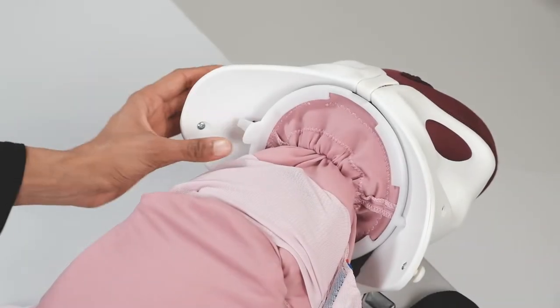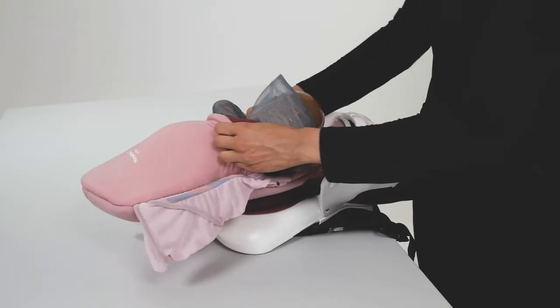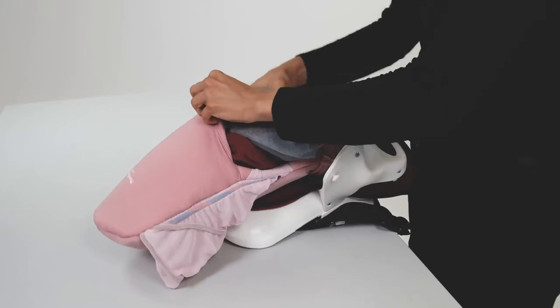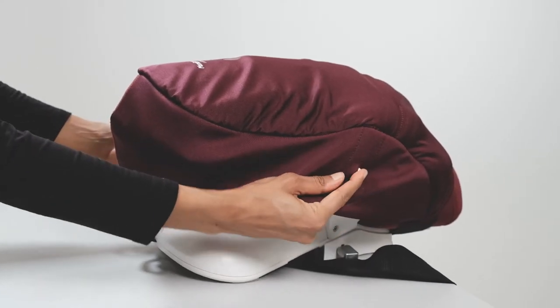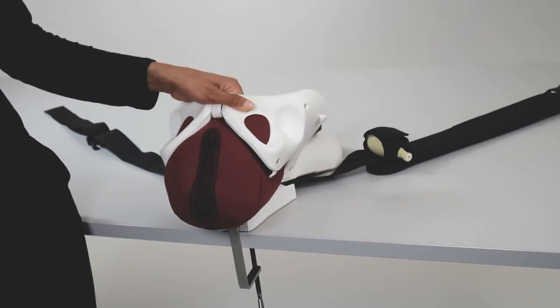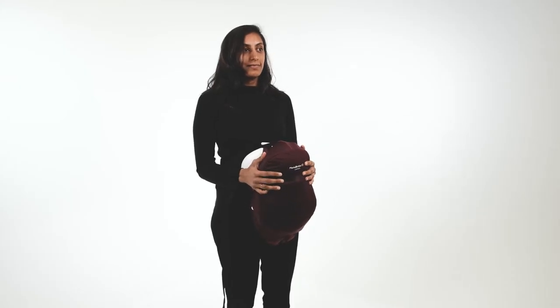To set up, connect the CS uterus to Mama Berthi and position Baby Berthi inside the uterus. Cover with the CS abdomen skin. Mama Berthi CS can be used on a tabletop to demonstrate skill, but it's most effective when worn during simulation.